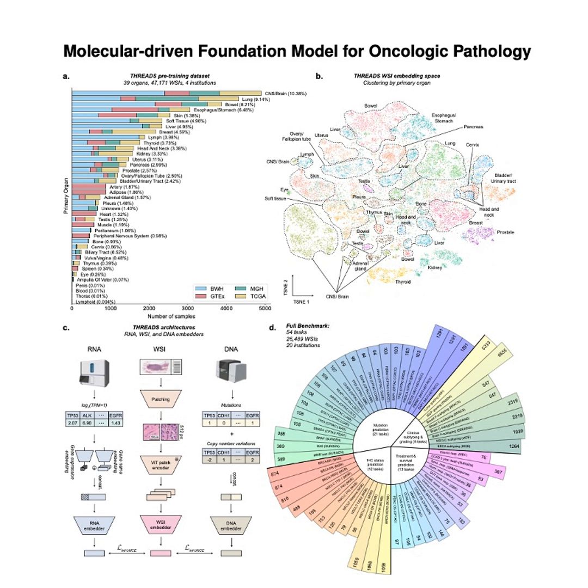Exactly that. Imagine you need to classify a type of cancer slide, maybe based on a newly discovered molecular marker, but you haven't had time yet to collect and label images of that specific marker to train the visual part of the AI. Okay, how could Threads possibly do that? It cleverly leverages its molecular branch. Researchers can take known molecular profiles, say the typical DNA or RNA signature of an IDH mutant glioma from a separate established data set, and encode that signature using Threads' DNA/RNA component.